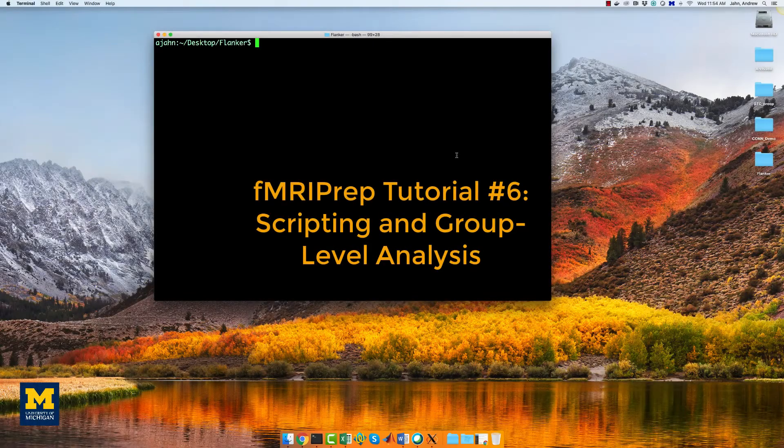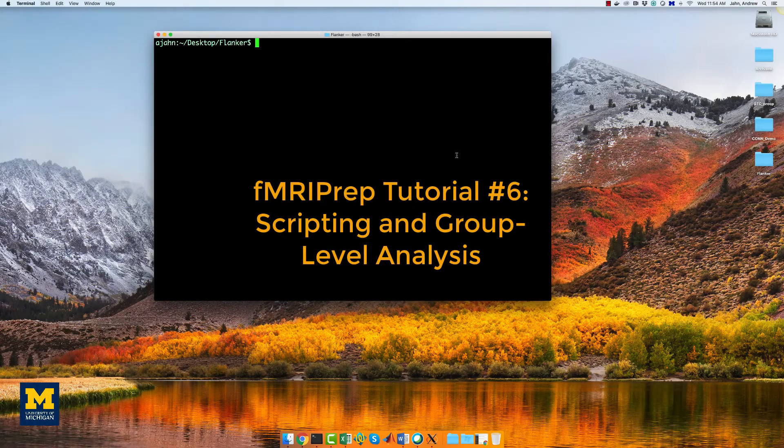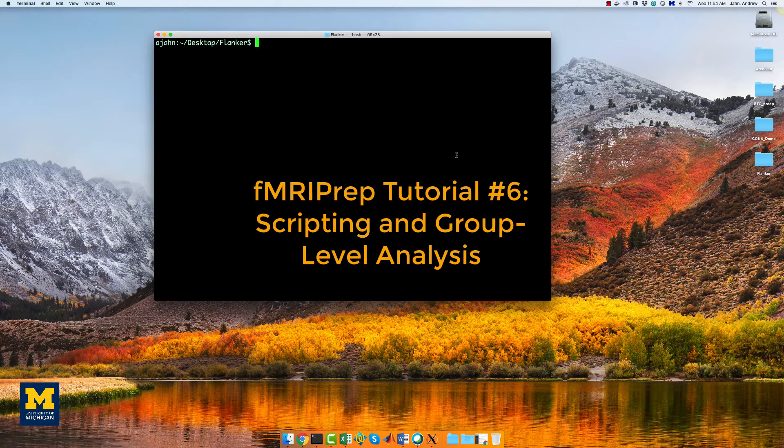Now that you've seen how to preprocess and analyze an individual subject, it would be helpful to create a script that automates it for every subject.